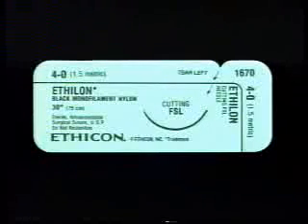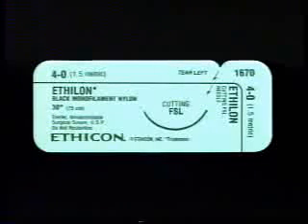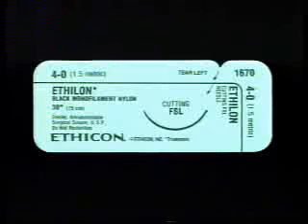It is important to look at the package to see the size and the type of suture, as well as the size and the type of needle. A cutting needle is preferable for use on skin. A taper needle does not easily penetrate skin and should be avoided.